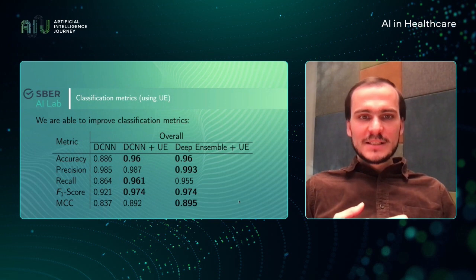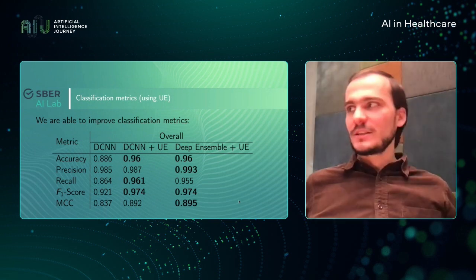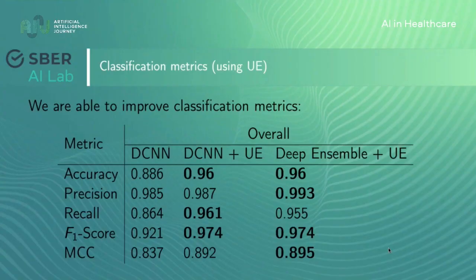And in this table, we show that such an approach towards recovery of segmentation improves our segmentation results. A proper prediction is a prediction where the marking made by the model overlapping with the doctors' ones is not empty in frontal and lateral views, and all classification metrics grow dramatically. We should compare bar 1 and 2.